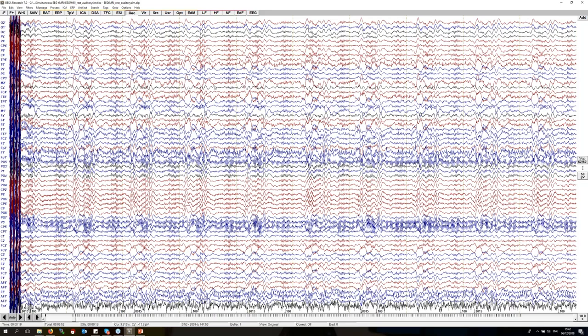This is due to the blood flow inside the magnet. You can see these recurring artifacts here. The blood contains charged particles, which again create an artifact in the magnetic field. But this artifact can be dealt with using standard BESA artifact correction. We can simply average over multiple occurrences of this and then apply our artifact correction toolbox.